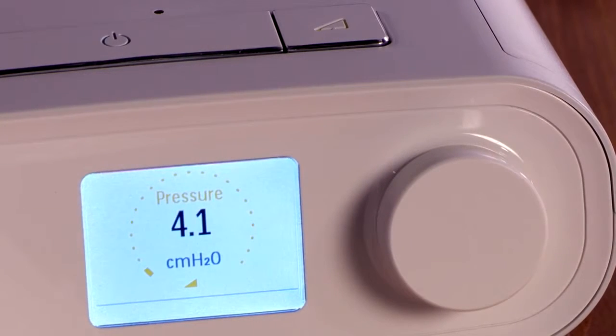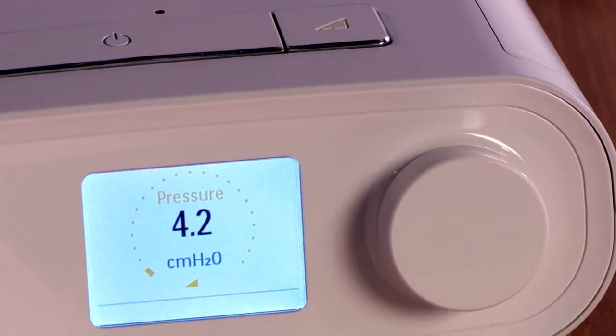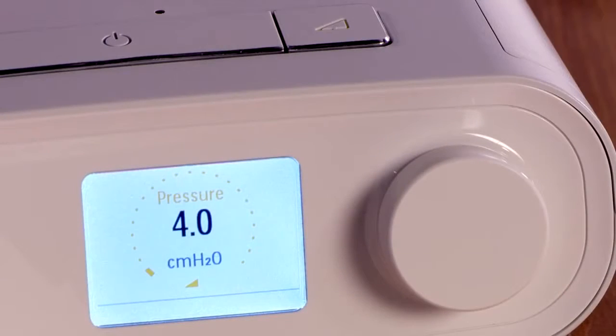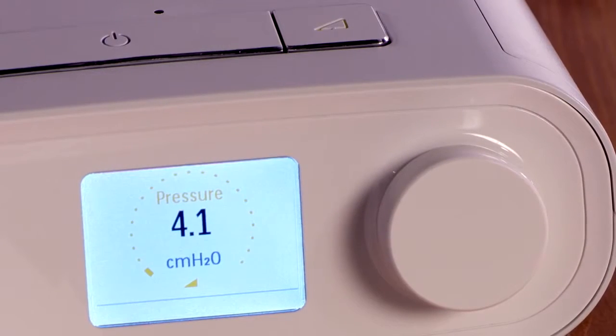Ramp reduces the air pressure when you are trying to fall asleep and then gradually increases it to your prescription pressure. To stop or restart ramp, simply press the ramp button. You can do this as often as you like during the night.